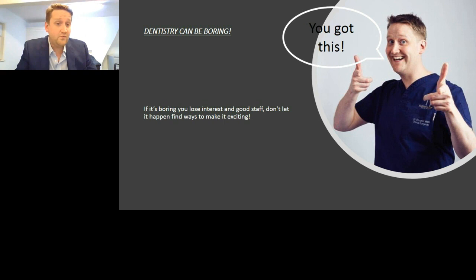It's really useful if you can get the patient to do what you're asking them to do, because then you get all those excursive movements that are the patient's actual movements. You don't have to rely on average values on a digital articulator. But yeah, there are those odd patients who just will not. You say to them, grind to your right, and they go, how's that? They open their teeth up, throw their jaw all over the place. So it's not always easy, but with a bit of guidance, most people can do it, and it does work well.